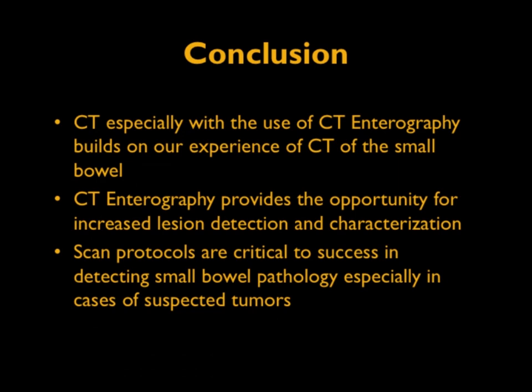dedicated CT studies are excellent for looking at the small bowel. We do a good job picking up small bowel pathology even when it's not a dedicated study, but dedicated studies do better, particularly for smaller lesions. CT enterography provides not only increased lesion detection, but also classification and planning of therapy. And of course, as we mentioned from the get-go, as with everything we do, scan protocols are so critical. If you don't have good protocols, you're going to miss the lesions.